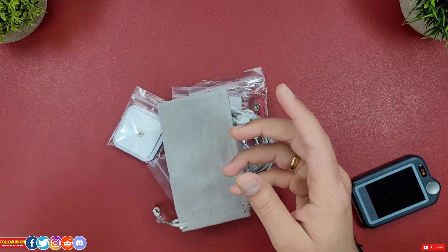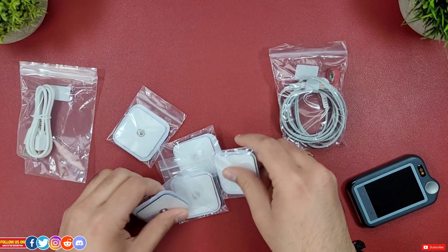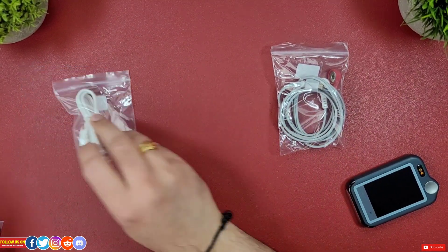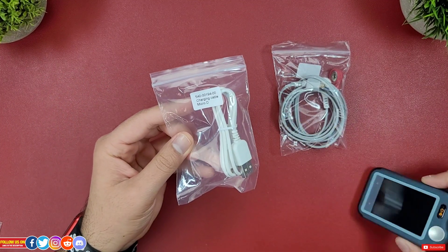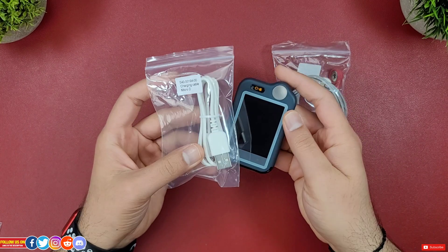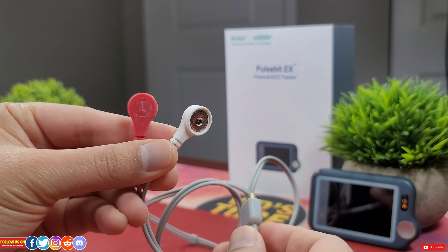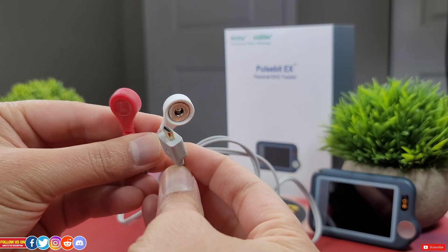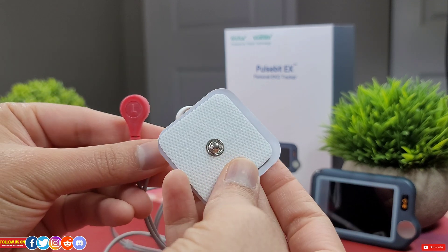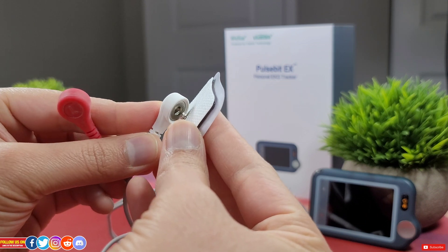Moving further down in the box are all the goodies: a neck strap, a carrying bag, and 10 additional reusable electrodes. This unit uses a micro D port for both charging and data transfer to your PC, though you'd rarely use that if you have a smartphone since there's a Bluetooth data transfer option. There is also an ECG cable with the same micro D port, and the reusable electrodes attach to this cable by a push-lock mechanism.